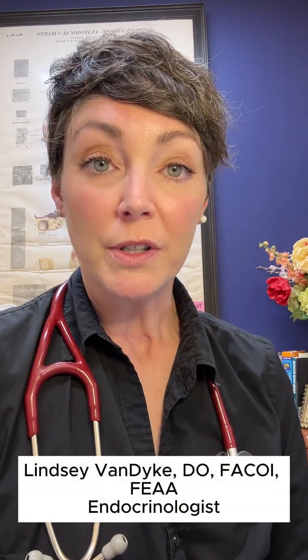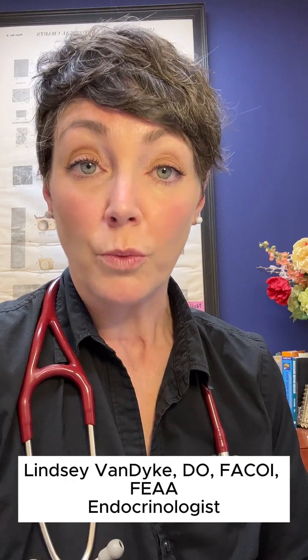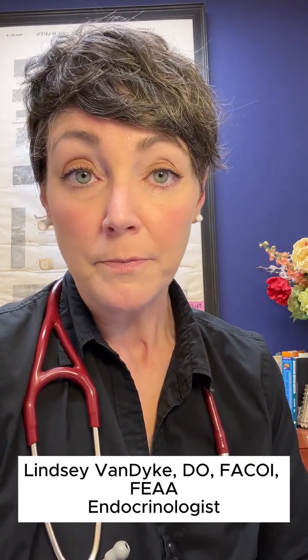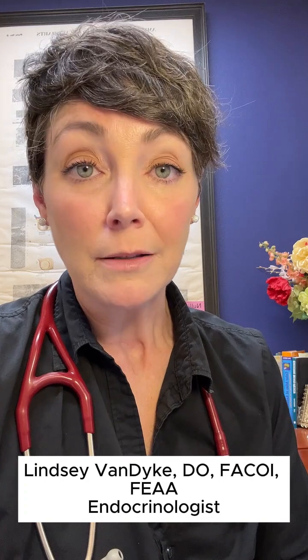I'm going to take you on a tour of DiaDirect, the app that's designed to enhance the care of patients with diabetes. DiaDirect is like a hotline right to your nurse, who can see information real-time about your vital signs. They can intervene early if needed. This information can be sent also to your cardiologist, nephrologist, or primary doctor if needed.